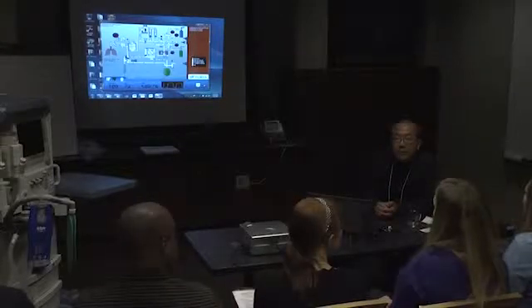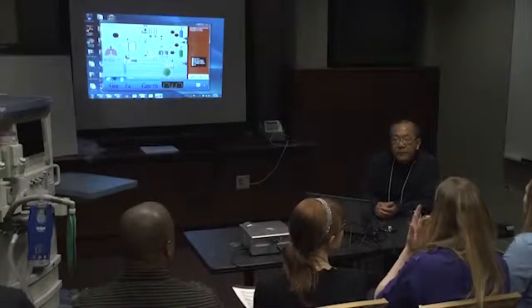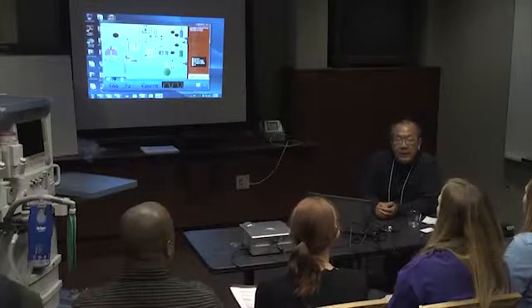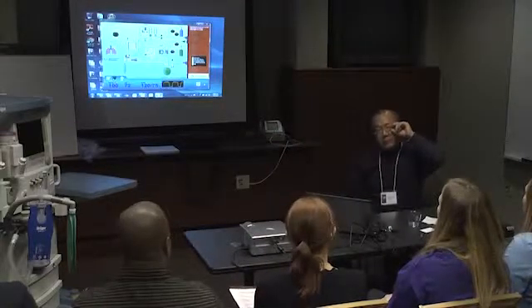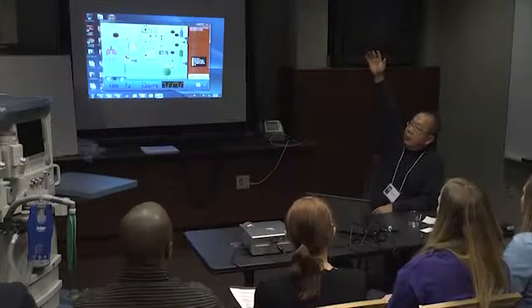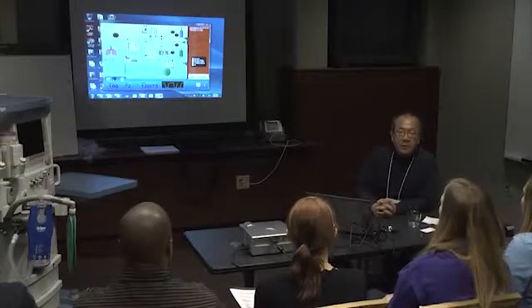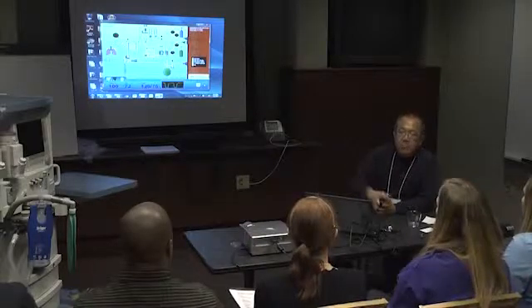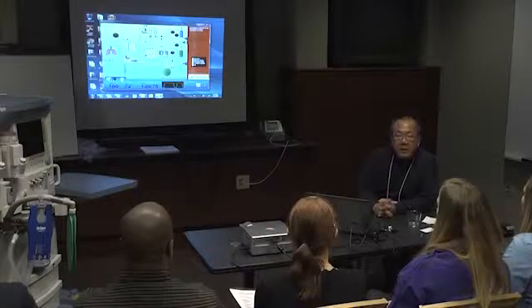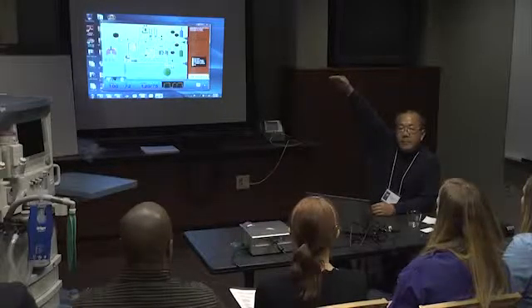Oh, like if the oxygen just runs out and there's very little gas running through? In a rural hospital, most likely they won't have those. Have you seen an oxygen storage system like at Northwestern? It's a huge cylinder, two stories tall, filled with liquid oxygen. So that could last weeks, a week at least. But in a rural hospital, they can't afford that. So what do they use? They use big H cylinders, which are as tall as me.